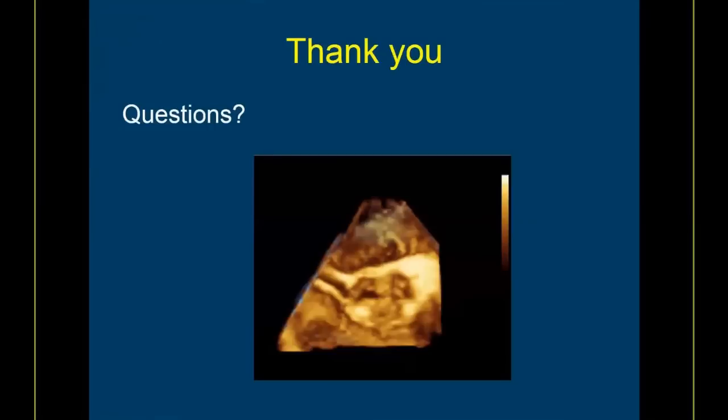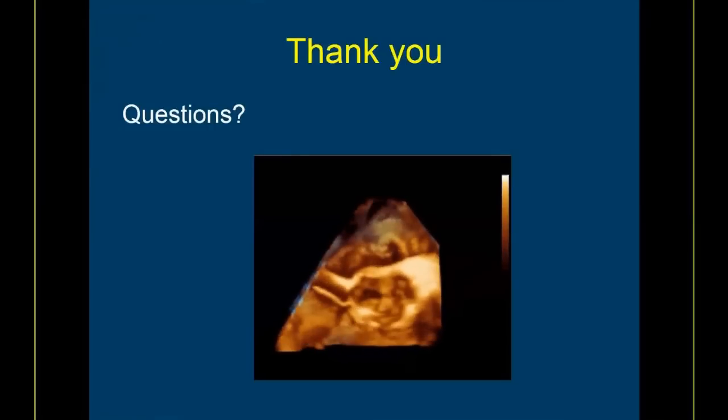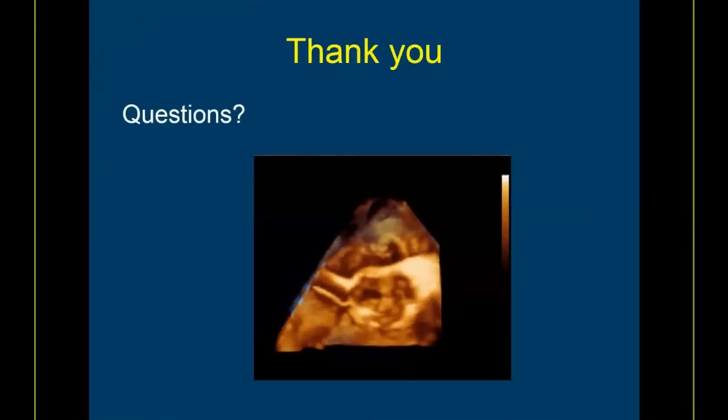One question is, what is your approach to assessing aortic stenosis in the presence of a subaortic membrane or HOCM? My approach is to give that to my colleague who's sitting next to me usually. So this is stenosis in series. It's always surprising to me how often they're together. I see a lot of subaortic membranes in conjunction with valvular aortic stenosis.